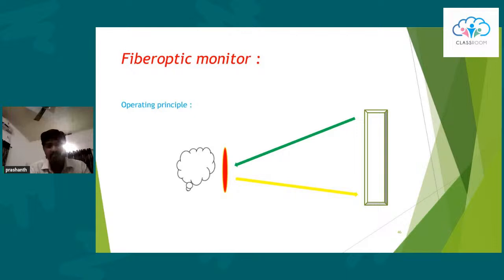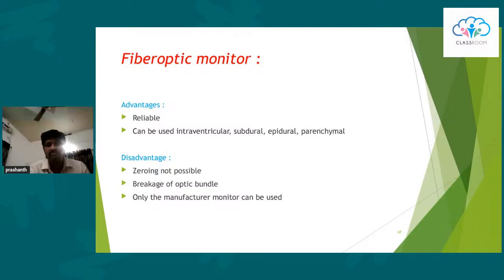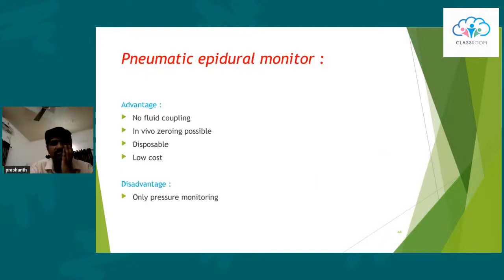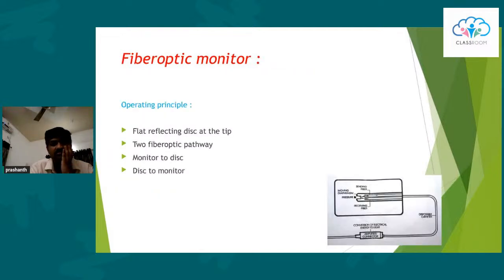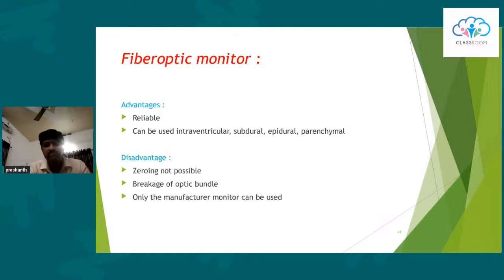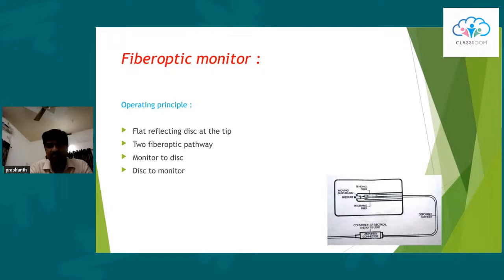Then I'll just briefly give an overview of the non-invasive techniques. Okay, transcranial Doppler.